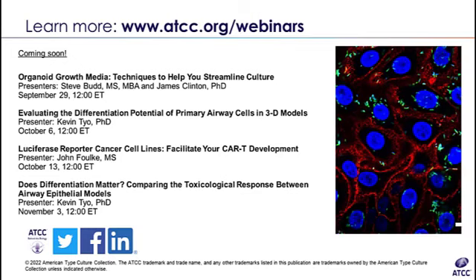Yeah, that shouldn't be a major issue. With most suspension cells, you are going to see sometimes one or two, a few cells attaching. You shouldn't really see that. If the cells are designed to be in suspension, using a culture-treated flask is not going to cause them to adhere, at least to the level that you'd see for other adherent lines. So it should be fine.